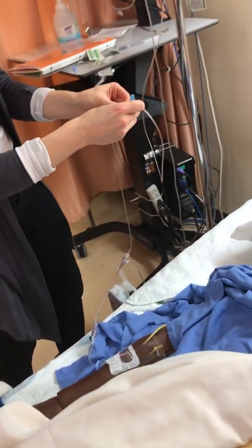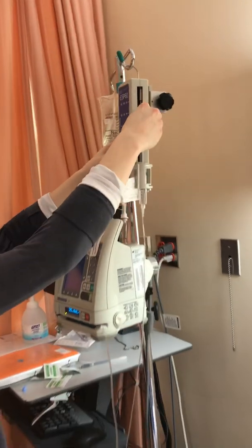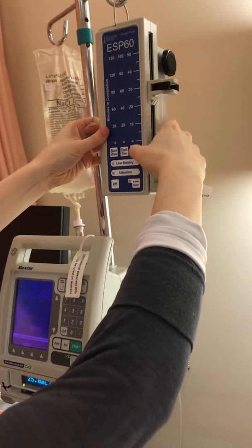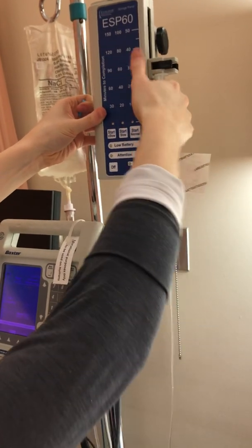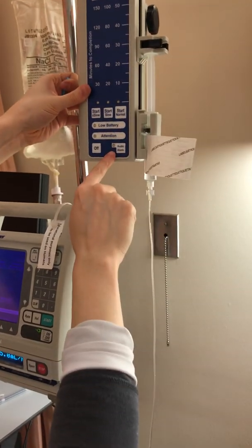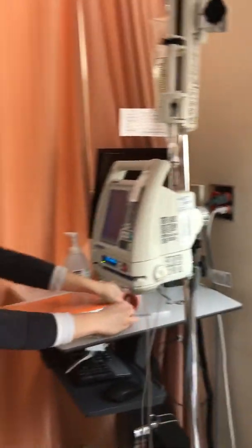I will unclamp this. This is down. It should be at around 26 minutes, which looks about right. So I'm going to turn this on. So start normal. I want it to be on this normal, and I want to make sure that the audio alarm is on. Okay, so at this point, my drug will be infusing.